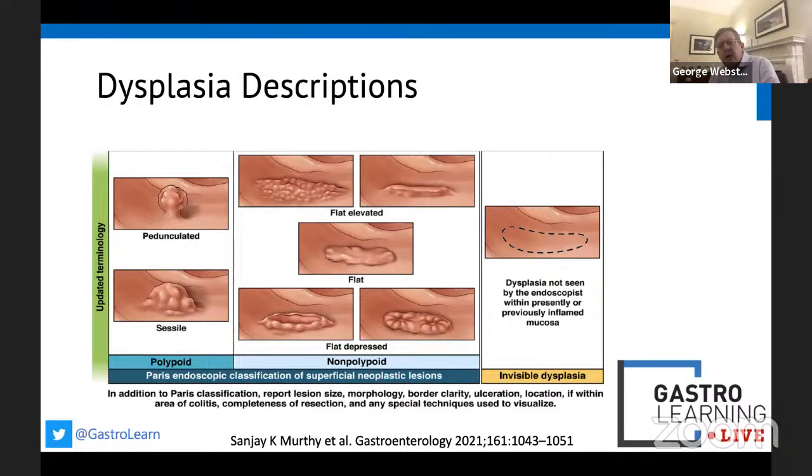And can I just ask? I know it's a whole other topic, but within most services, there are excellent colonoscopists who are committed to the bowel screening program. There may be one or two who are spending much of the day doing high-end endoscopic resection, ESDs and others. Who should be doing the IBD surveillance? Because in many units, there are quite big numbers of patients. But we work in ivory towers, so in usual practice, who should be doing these cases?